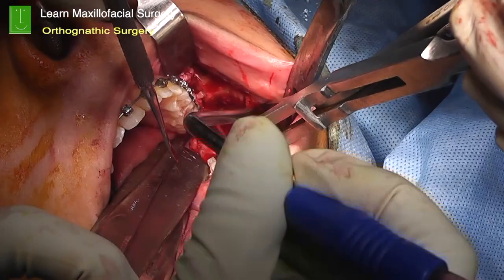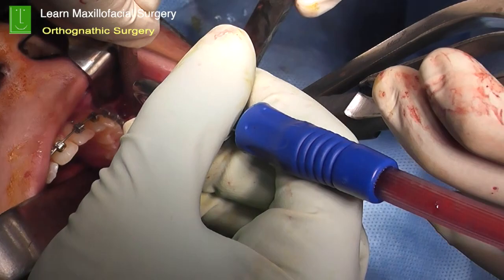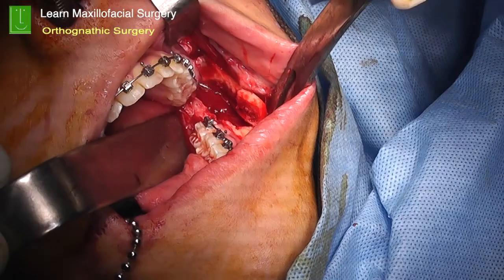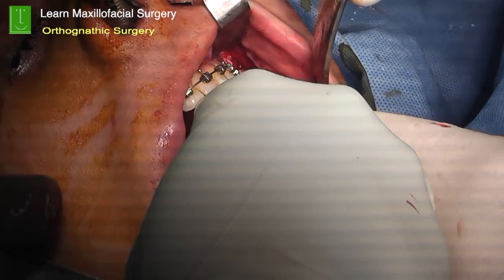So once you free the nerve completely, then you can go further down and complete the split. So you can see the way in which our Smith spreader is basically spreading the sagittal split in the ramus of the mandible, identifying the nerve. So a good suction is very, very important at this point of time. You can use a bit of irrigation also so that you can actually identify the nerve, see the way in which the Smith spreader is spreading the sagittal split, and you can see the nerve basically right in between.